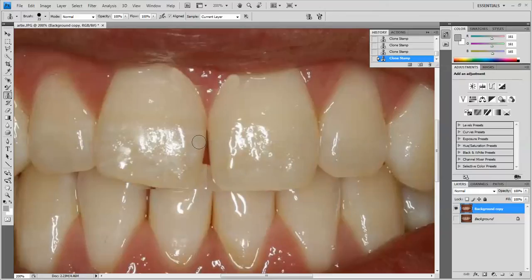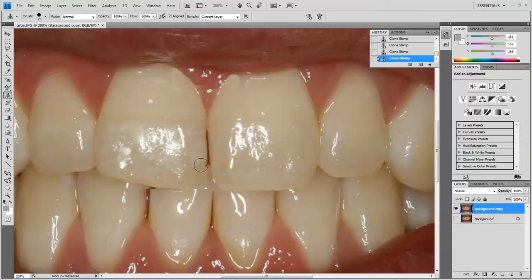I'm going to take another sample in this area and we're going to start just adding to the contact. This is just like waxing, just doing it virtually. As you get on down to a different part of the tooth, you probably want to sample again, because the tooth will change as you're going down it.